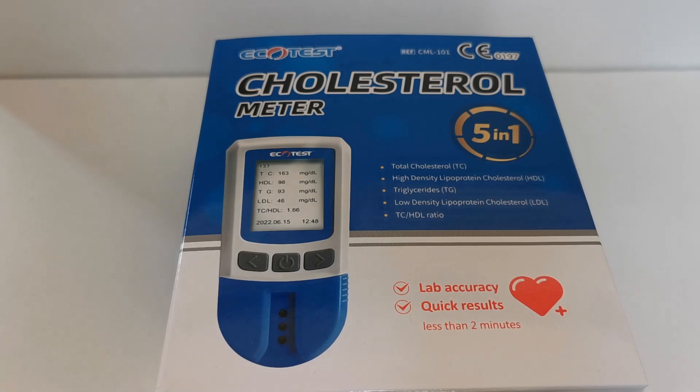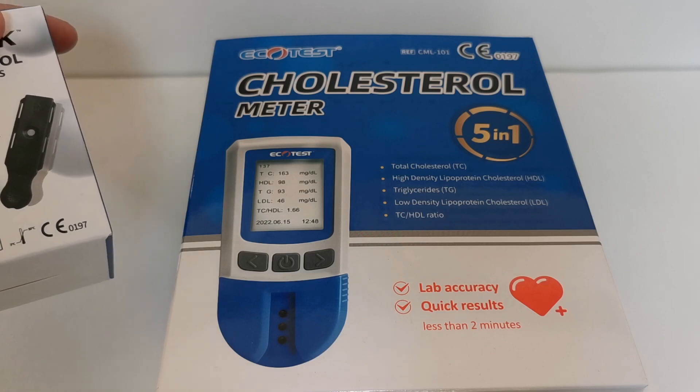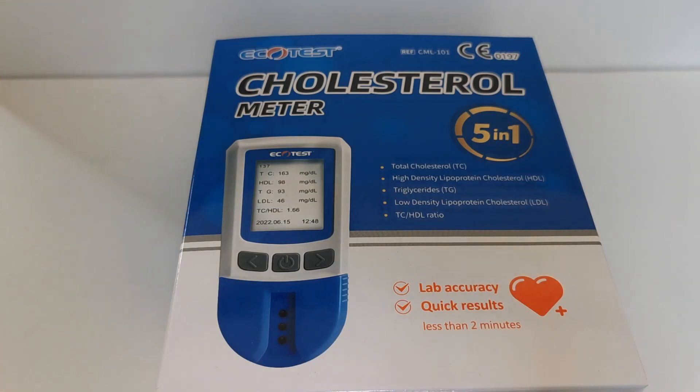The meter itself — we're going to show you the pack contents and how to set it up in this video. Test strips — they are test devices really, coming in packs of 10. You also get capillary transfer tubes, a code chip, a device insert, and some safety lancets with the refill packs of cholesterol devices.